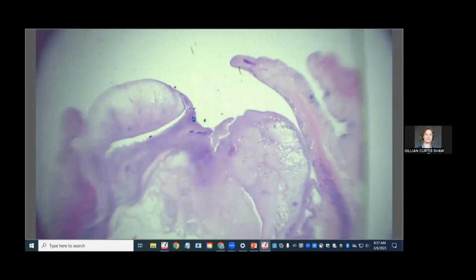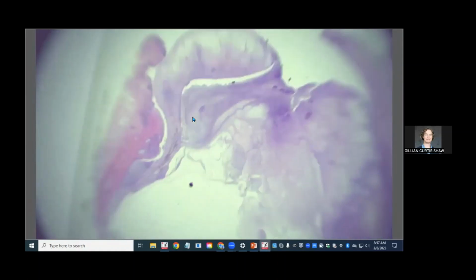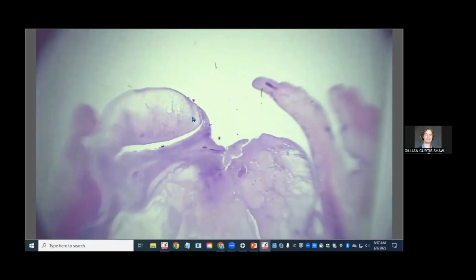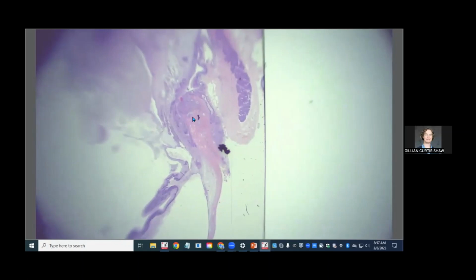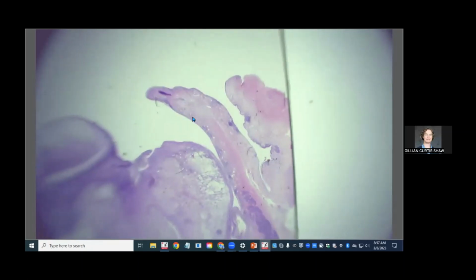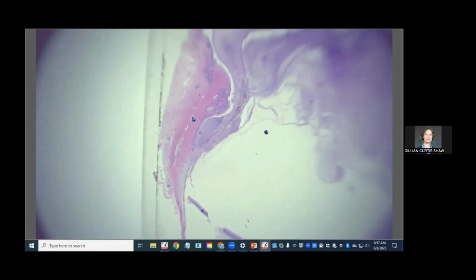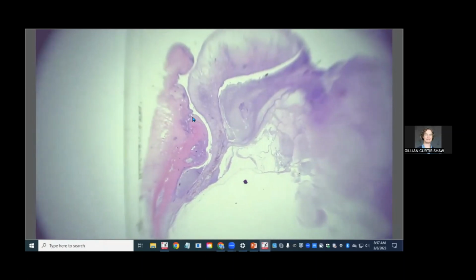So like I said, this is the iris that is now performing the role of the cornea, or trying to. This is also iris attempting to perform the role of the cornea. This is sclera right at the limbus where the cornea would have begun. Here we have third eyelid. On the other side, we also have sclera that stops right at the limbus. Maybe there's a tiny little bit of cornea.